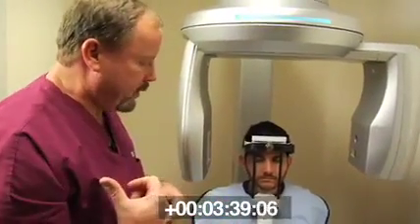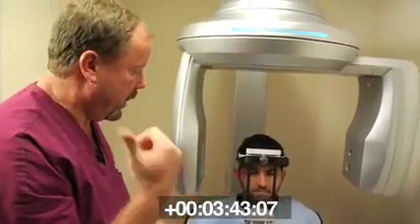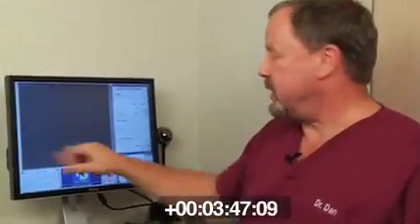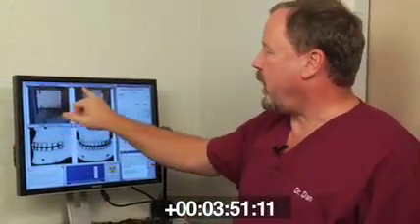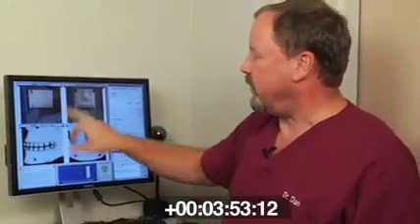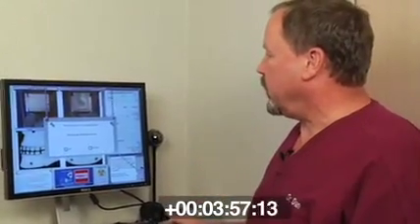So we'll step back out to the monitor, and we'll show you how we position the patient remotely on the TV monitor itself. The patient is seated, and now we're going to position off of the screen here on the TV. And you'll see up here 2 highlighted areas that actually show the areas of interest where we're going to be doing our scan. So we'll do next here.